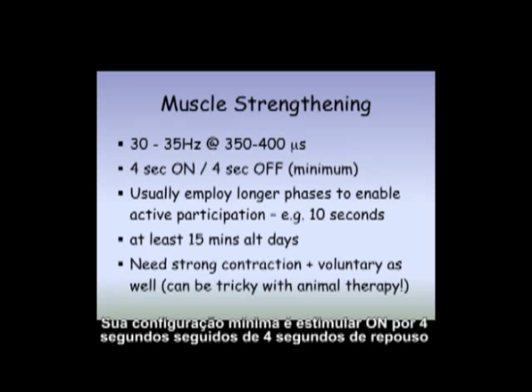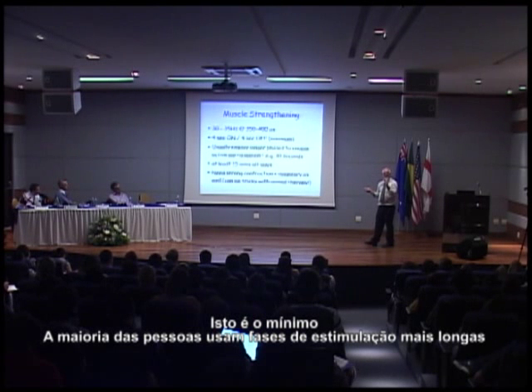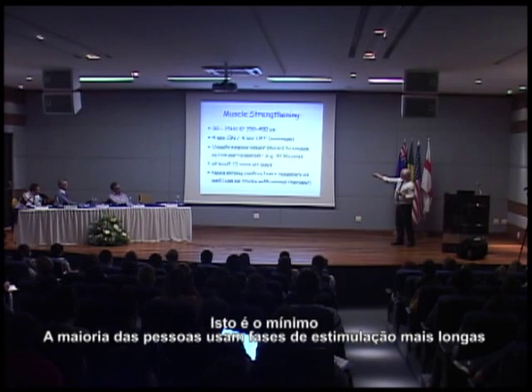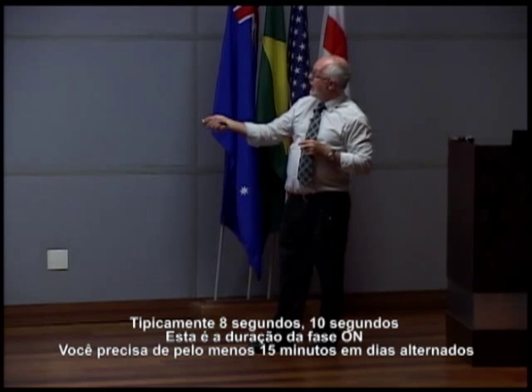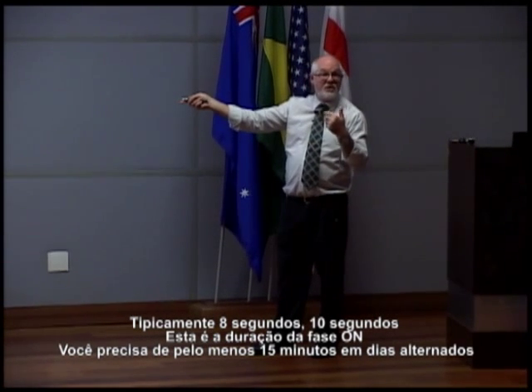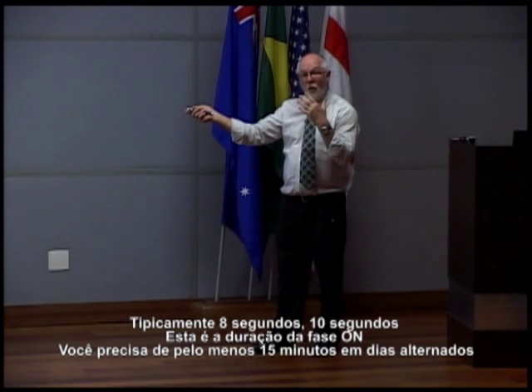Your minimum setting is to stimulate on for 4 seconds, followed by 4 seconds rest. So 4 seconds contraction, 1, 2, 3, 4, let go, 4 seconds rest. That's your minimum. Most people use longer stimulation phases, and typically 8 seconds, 10 seconds, that's the duration of your on phase.